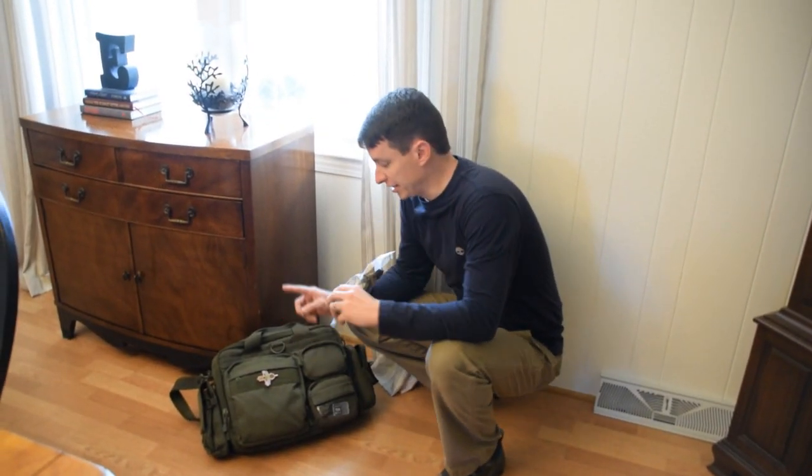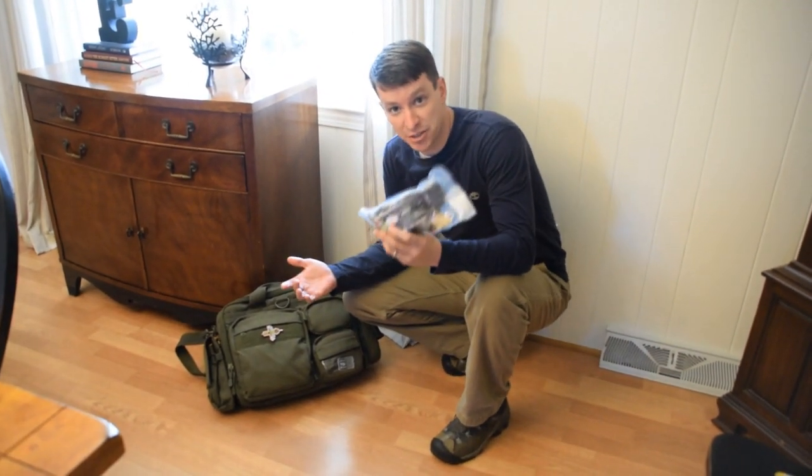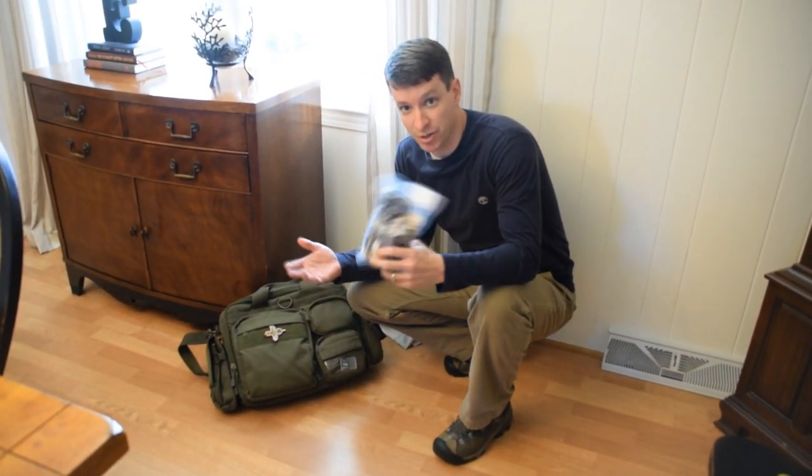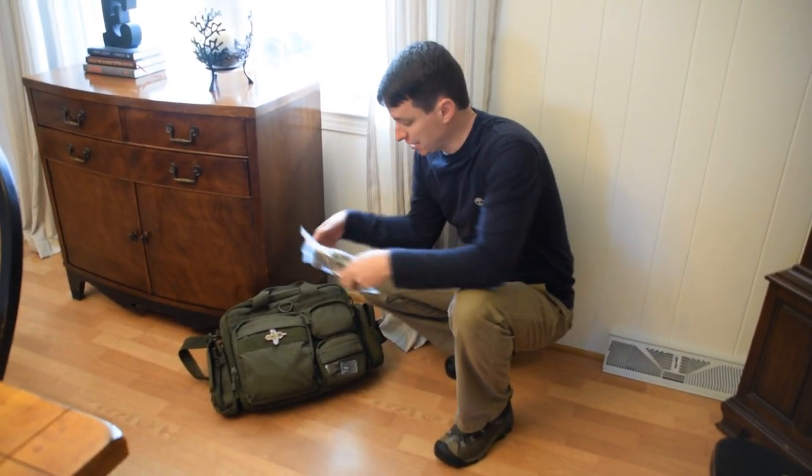This kit would definitely fit in something like this laptop bag, in the side pocket here. That way you could have a trauma kit at your office while you're working. You don't have to have a big bulky IFAK — this will fit right in your laptop case.